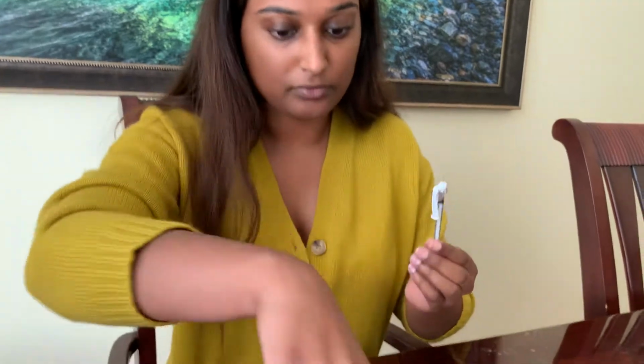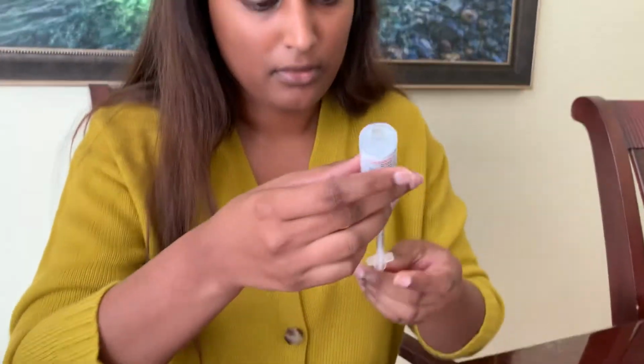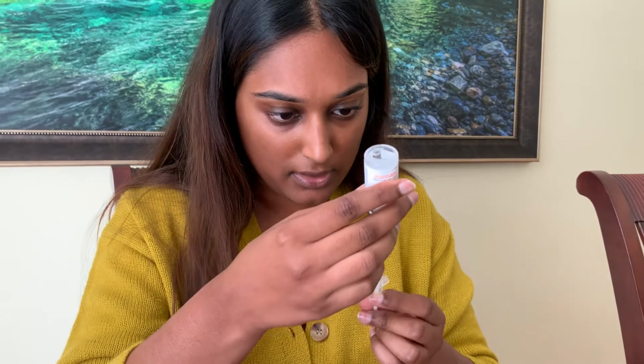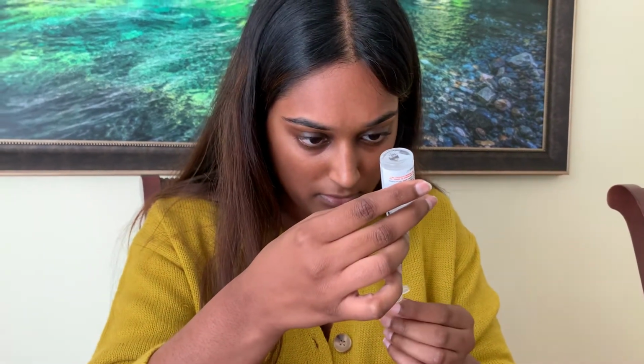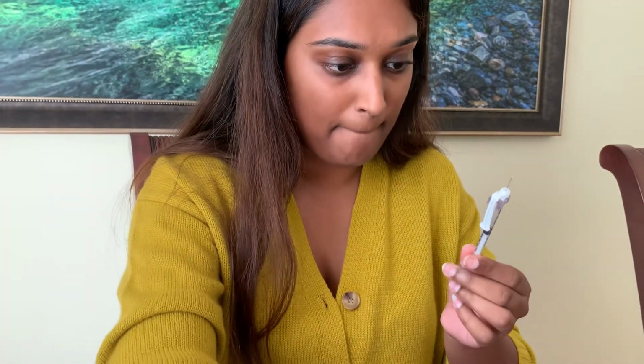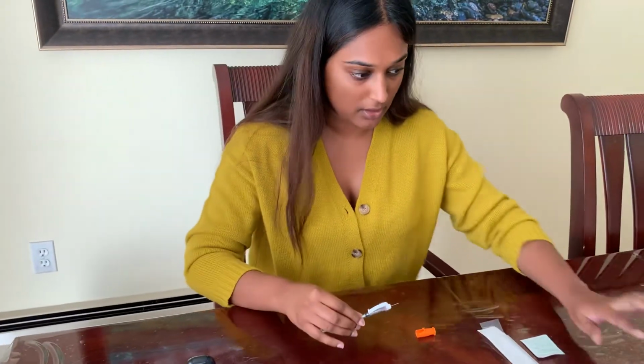Okay, and so all together it will be 26. I did the 4 of the other one, and then 22 of this. So 26 all together, as you can see. I don't have any air bubbles, so I don't need to get rid of it, but if I did, then I would.